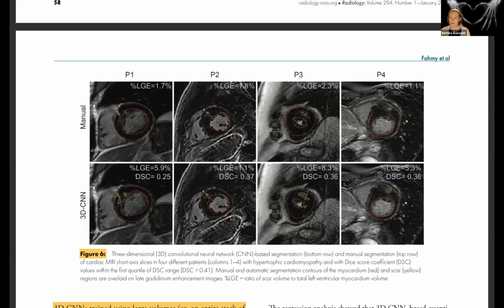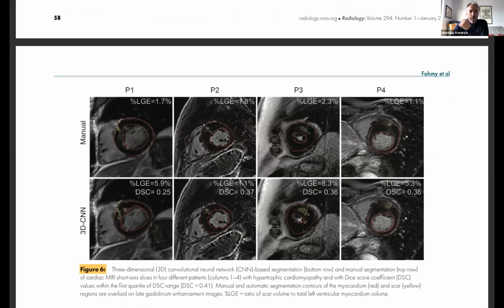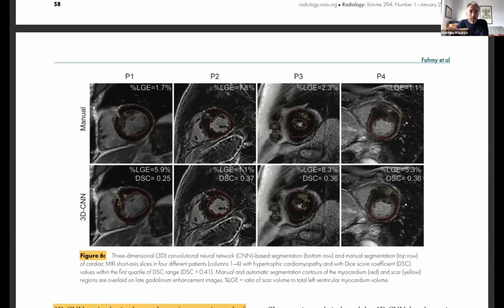Okay, so Matthias has a question. Just a quick one, and I may have just missed that. First of all, a comment: I think where it may be particularly helpful is differentiating artifacts from late gadolinium enhancement, because artifacts can sometimes mimic that, and for less experienced people, it's less obvious that their position and relationship with other anatomical structures give a clue. So that's where I see value. But the question I have is, it was a purely visual analysis, right? So of course the training of the algorithm will highly depend on the preferences of the reader. Did you also think of doing that with 3 or 5 standard deviations, a more quantitative strategy? I'm not saying that is necessarily better, because all these have also been standardized to visual analysis, so visual analysis is still the gold standard. But to make sure that the model is trained using a lot of different inputs.